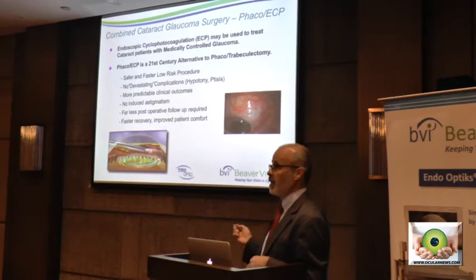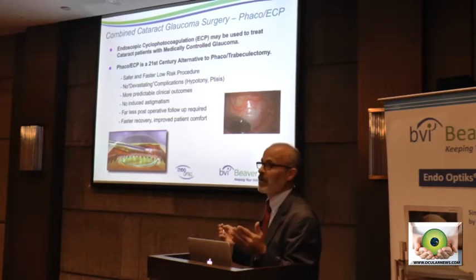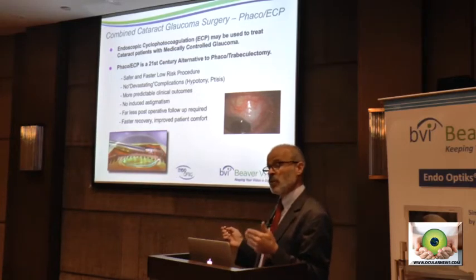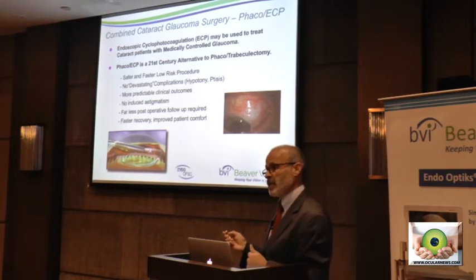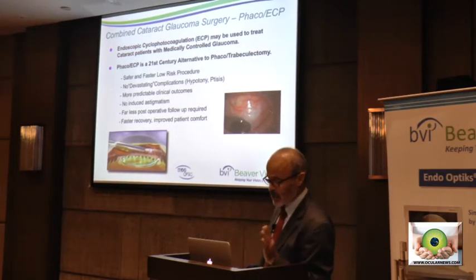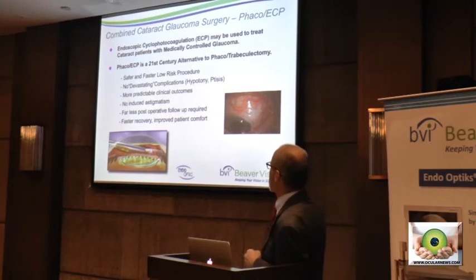So if you've had a patient, pick a VIP patient that you've done a premium IOL on, and now you're going to send them to a trab or do a trab in that same procedure, you might want to consider some other options. And we think ECP is a reasonable option to consider.